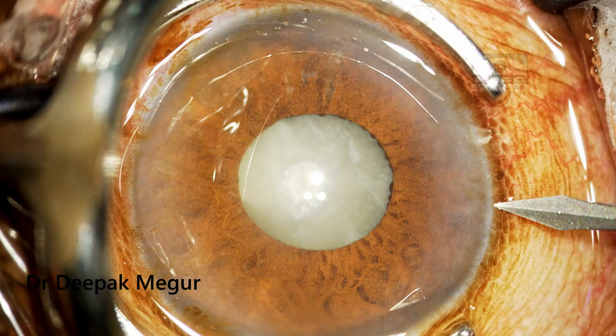Hi, this is Dr. Deepak Meghar and today I am here with another case of a non-dilating pupil with a hypermature cataract.